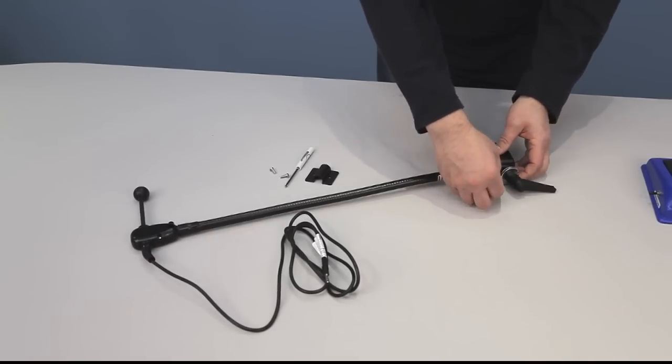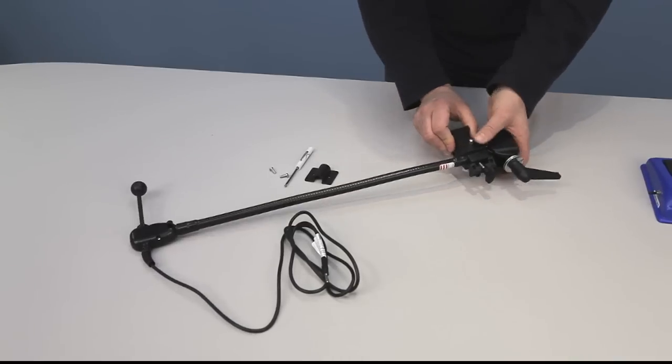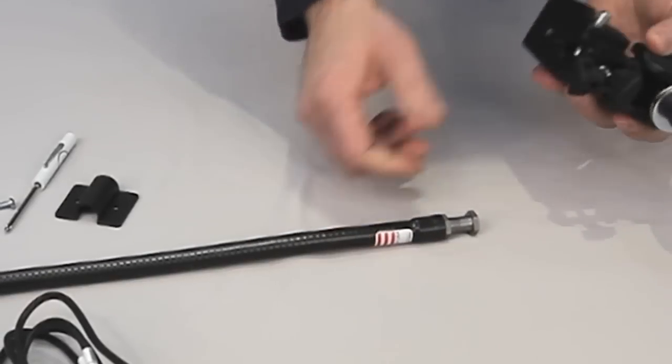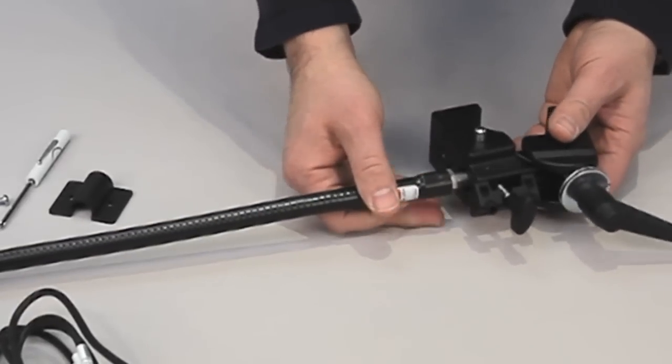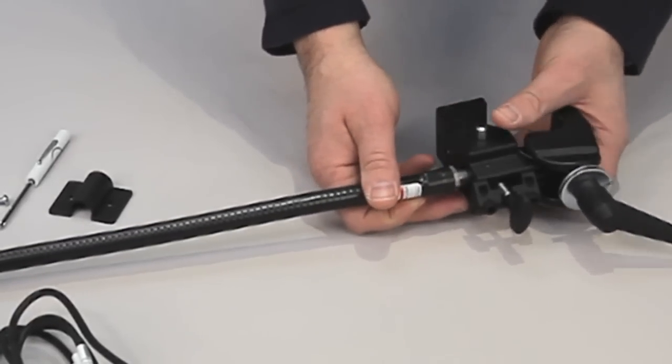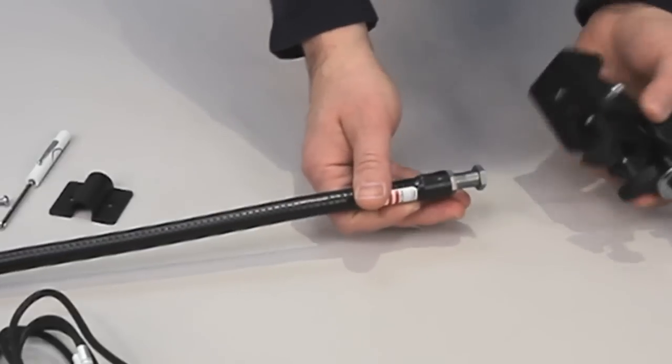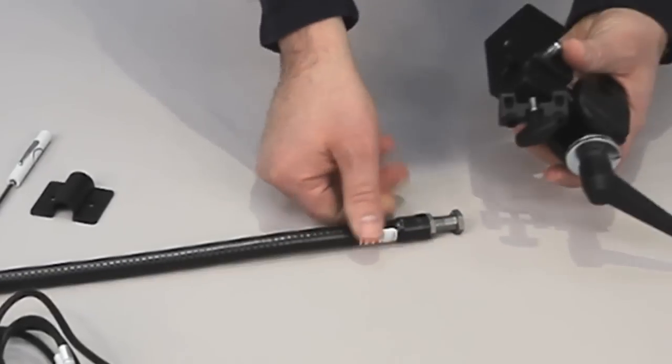There's a set screw here which you loosen up, and then there's a quick release button so that you can take this on and off pretty quickly. If you have extra clamps, you can have those set up at different locations. To install it, you set the screw, back the set screw out all the way.